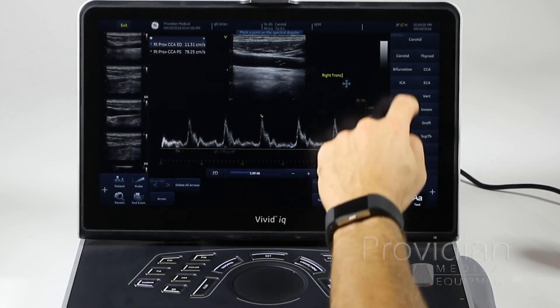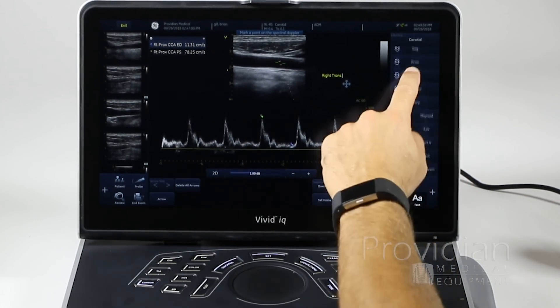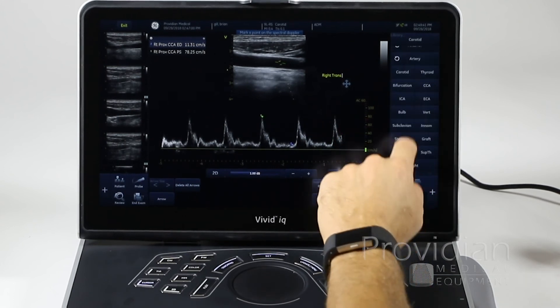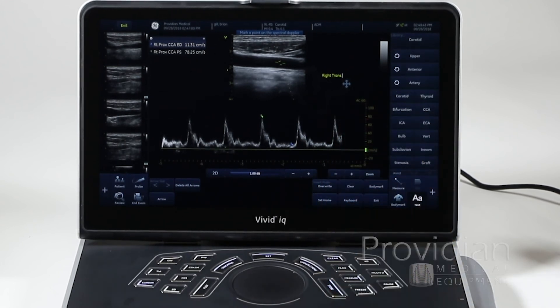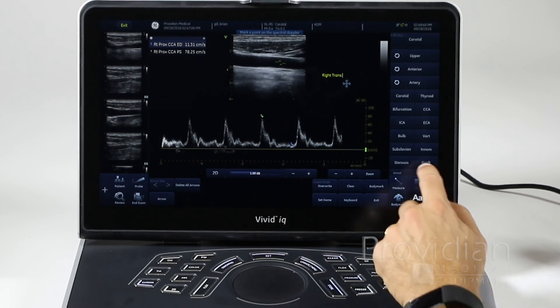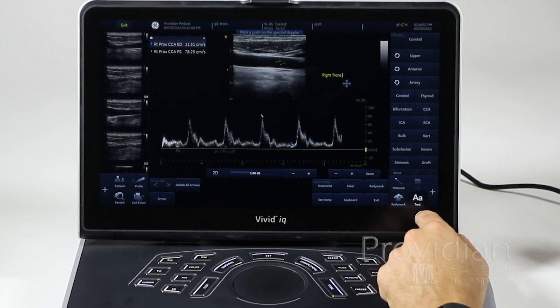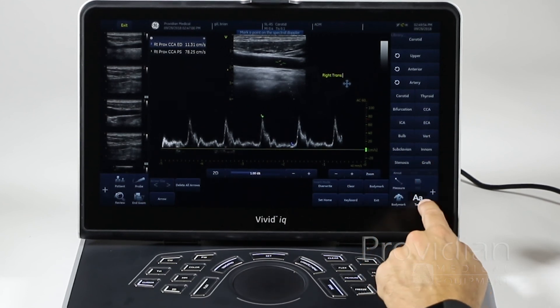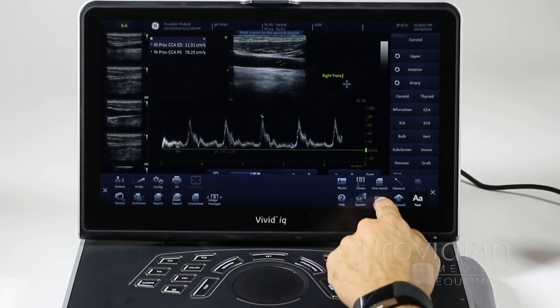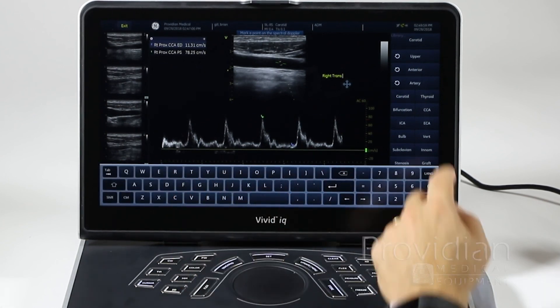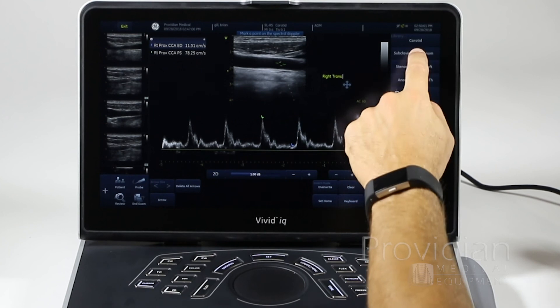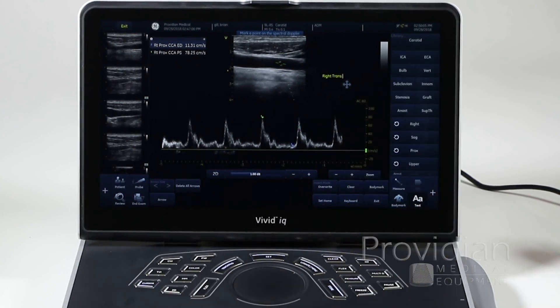You can scroll through this library — it's a customizable library where in the setup you can type in your own annotations and rearrange them all. This helps you avoid the pain of going to your keyboard and typing out annotations each time. This is a much easier way to go about it if you take the time to set it up the way you'd like. Next, we'll get into color and Doppler imaging modes.